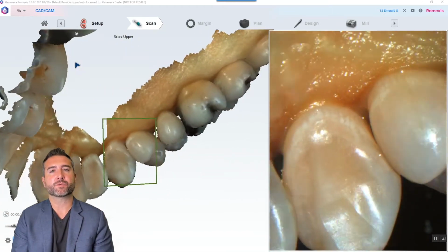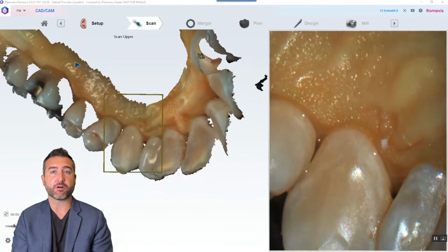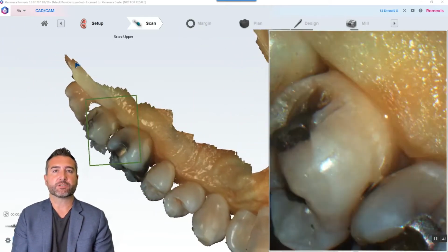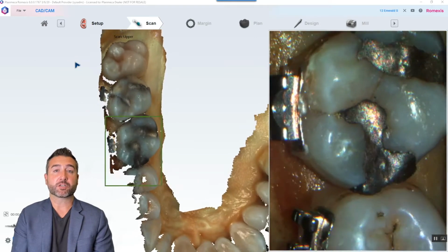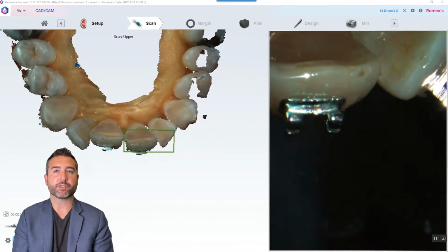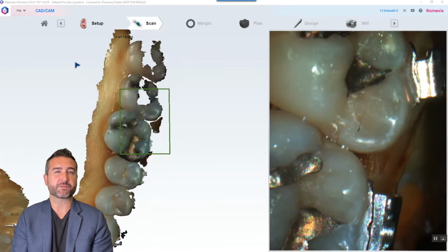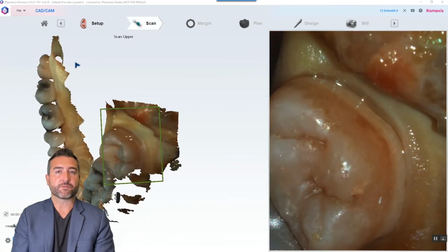Basically it starts with two coincident overlapping passes on the lingual surfaces to fill in all the lingual data. And it's really important to get that rotation in there so that you're able to get those undercuts on those premolars, which are sometimes notoriously difficult. Then you're going to get the incisal edge occlusals. And when you're going over the facials like this, it's important to get some of those facial surfaces on the anterior. So that's 3 passes so far.